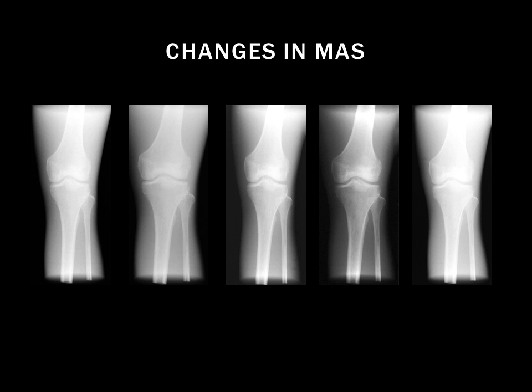So with repeats, you're going to have to know when looking at the image the first time how to adjust, instead of trying to repeat and repeat and repeat. If you looked at the first one, you would think, okay, let me try this and make it drastic enough to make a true difference.